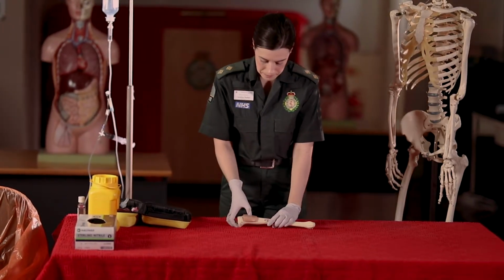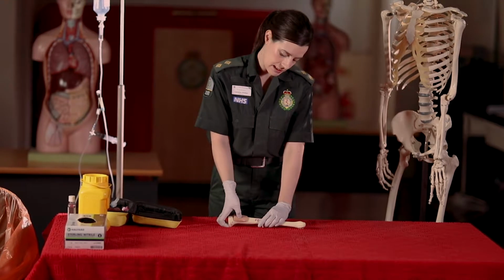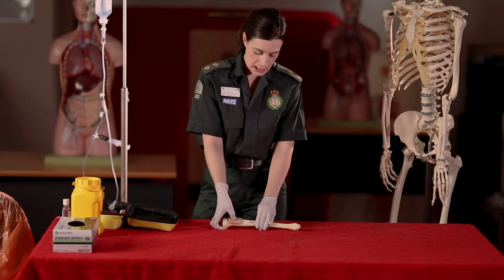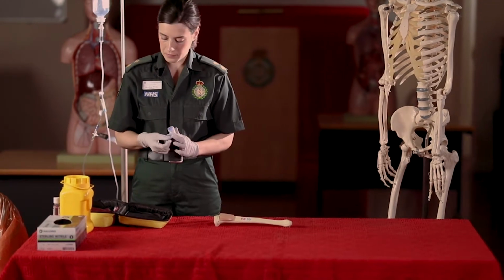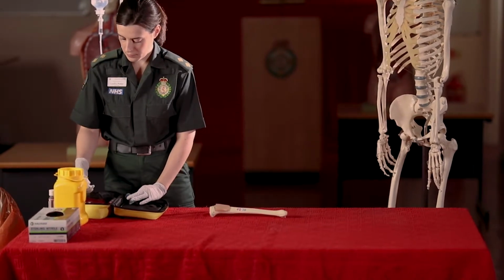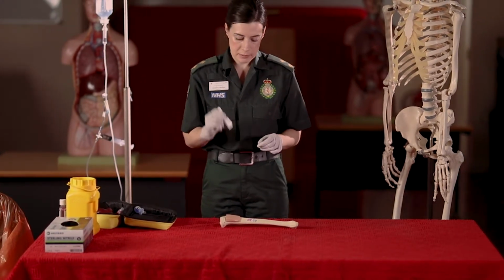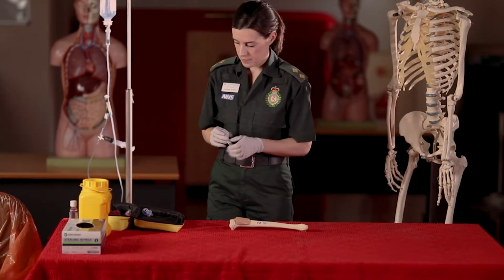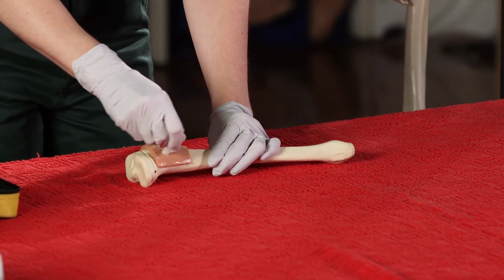Having found my site and assessed the tissue around the site, I can then gauge which length of needle I'm likely to need. And so for this site, and given the amount of flesh here, I'm going to opt to use the blue 25mm needle. I'm going to clean my site using a chlorhexidine, which I'll then pop into the sharps.